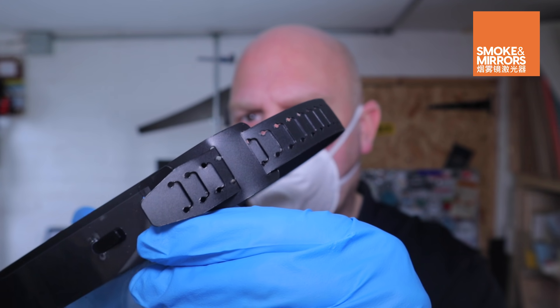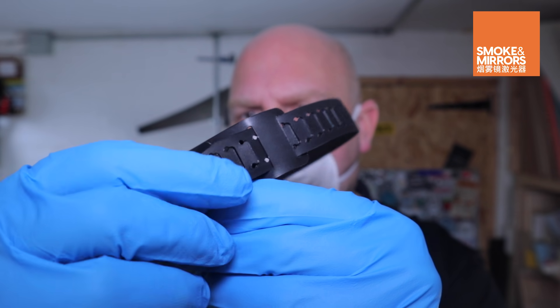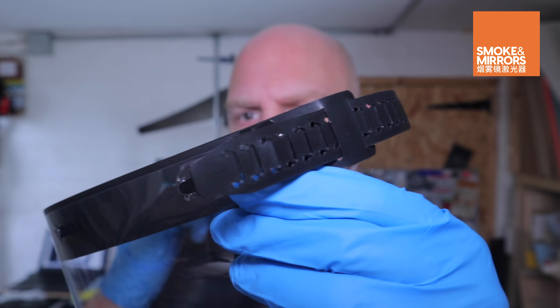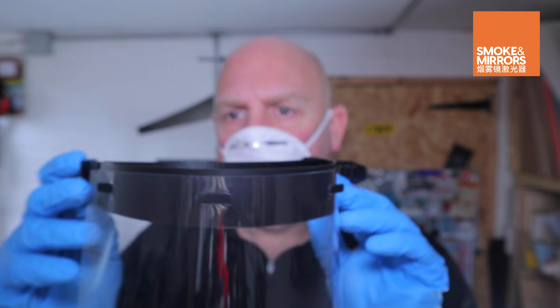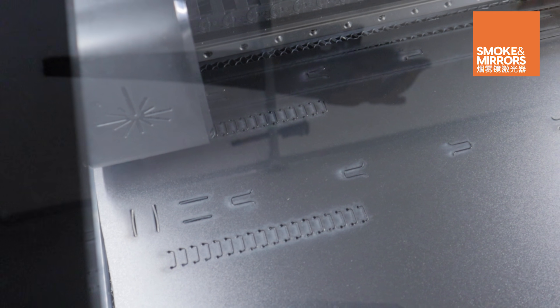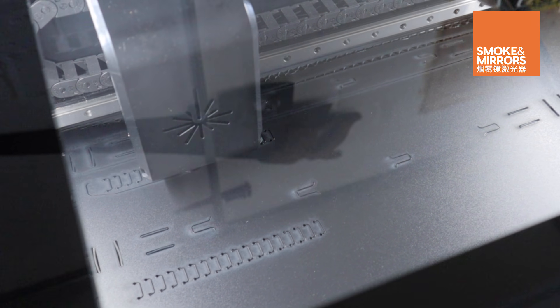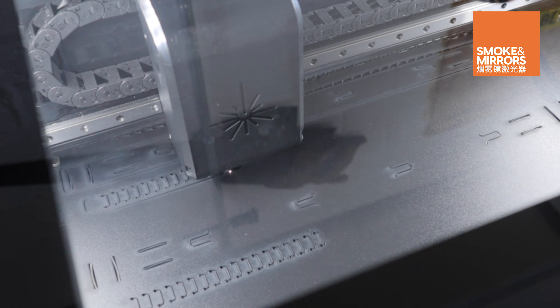The laser cut design includes a polypropylene adjustable headband, so unlike the 3D printed version, no additional elastic or fasteners need to be found. The headbands can be cut on a machine in minutes, rather than the hour or so it takes to 3D print the RC3 headband.